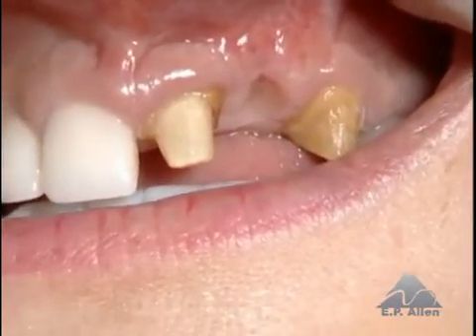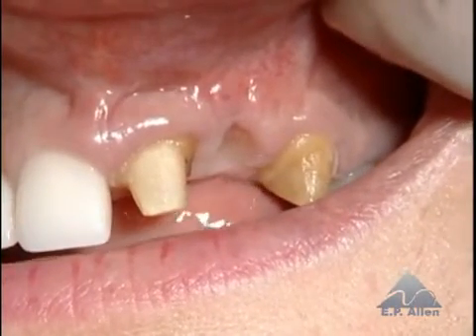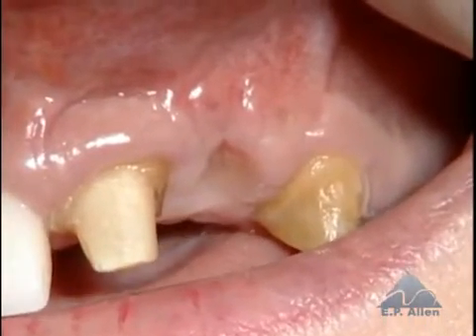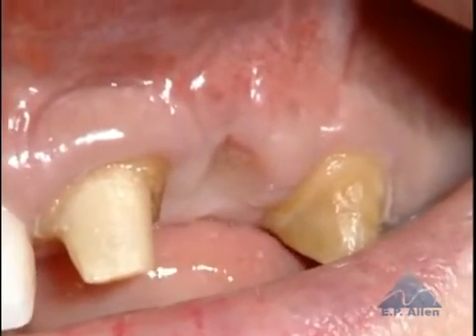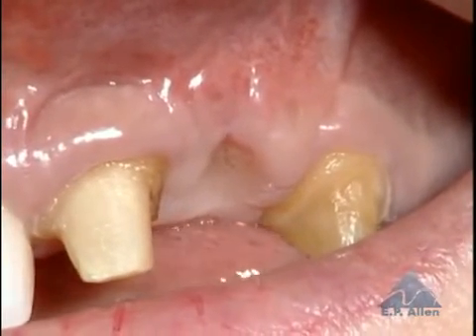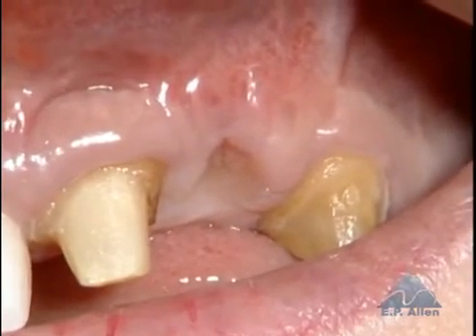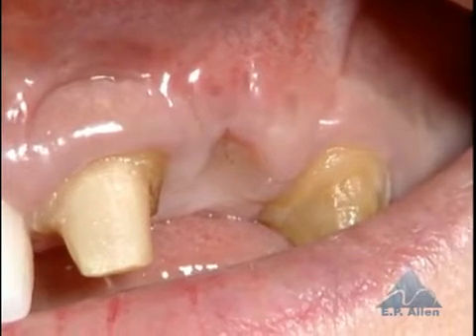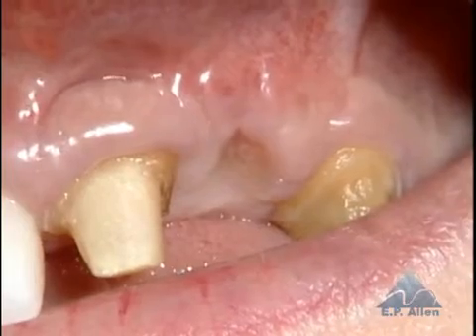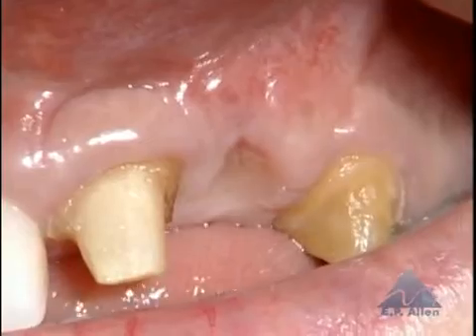And we have an ovate pontic site already where the pontic will rest into the ridge, and that's been established in the previous procedure. So we will treat that area as though it were a tooth and make our incisions as intrasulcular incisions around each abutment tooth, and then also make a similar incision around the pontic site so that we really are able to raise the papilla between the abutment and the pontic on each site and create a facial pouch. So we'll begin our incisions with intrasulcular incisions.